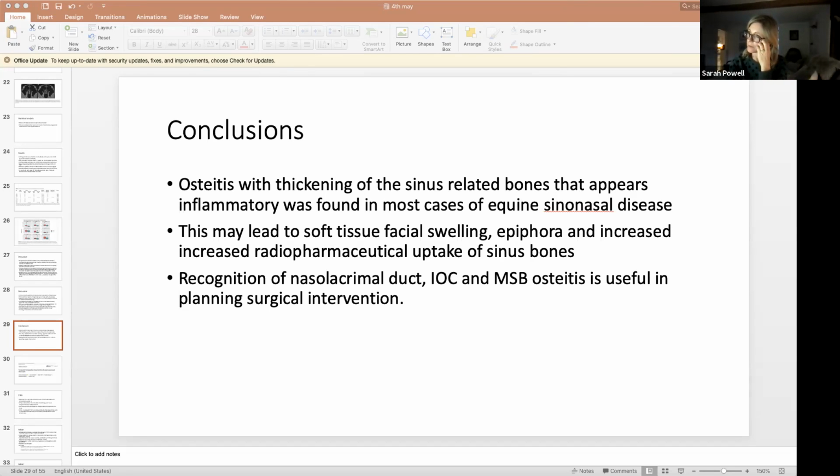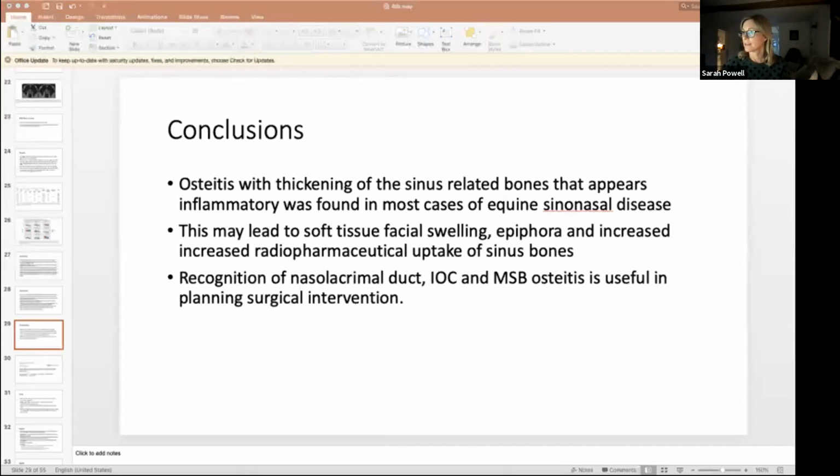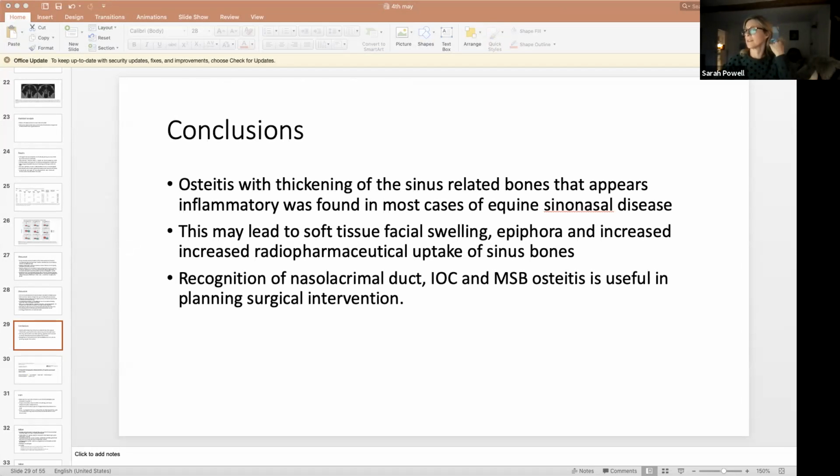I think you can obviously see some of them are thickened with your eyes without needing to measure them, but I think some of the minutiae that they're measuring, and how they make sure that it's all perpendicular, they do the MPRs, I'd love to see how they did that. Just because they're perpendicular to whatever they made themselves perpendicular to, it doesn't necessarily mean that the structures they're measuring are, because of the different shapes of horses' heads, if you see what I mean. Yeah. And I think that's a nod towards trying to standardize it a bit, but it seems like there's quite some margin for error in there.